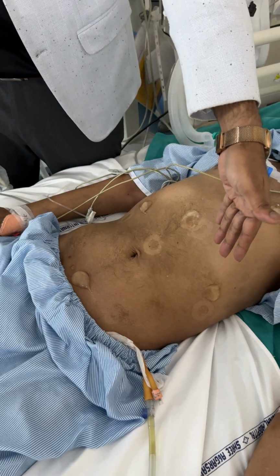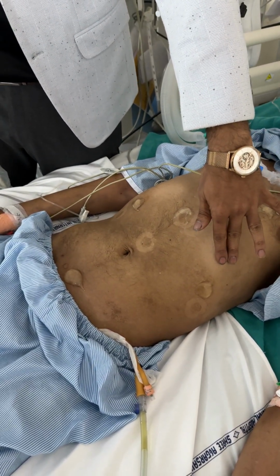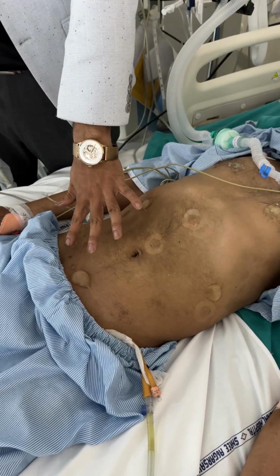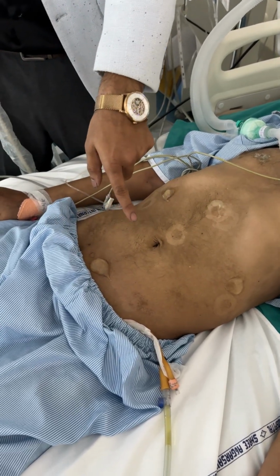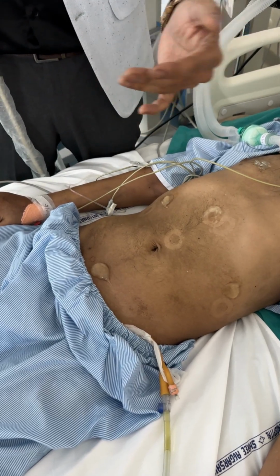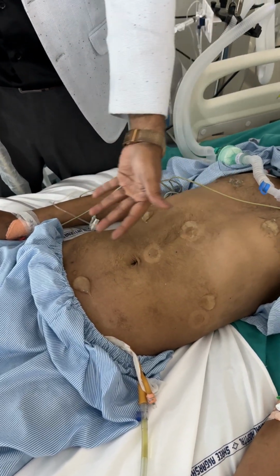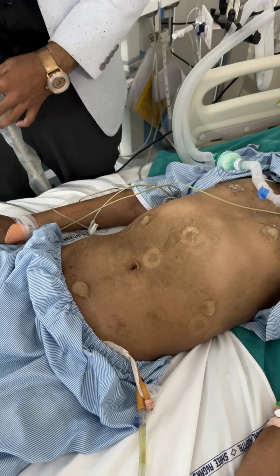The third point that we need to see is the left upper quadrant. What do we check in the left upper quadrant? The spleen, the splenorenal space, and the adjacent areas. And the last point that we used to see is the bladder, in the suprapubic area, the vesical area, and the paracolic gutters, both the right and the left, because any type of bleeding in the abdomen will ultimately seep into the paracolic gutters. So we'll see how we see.